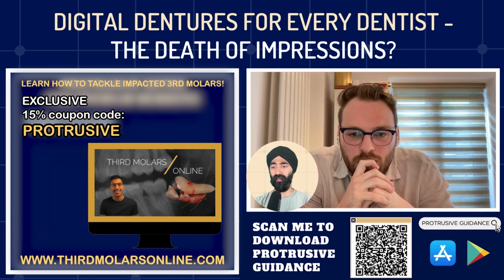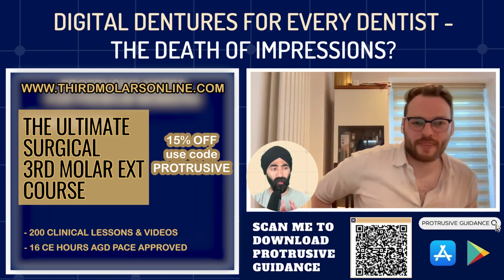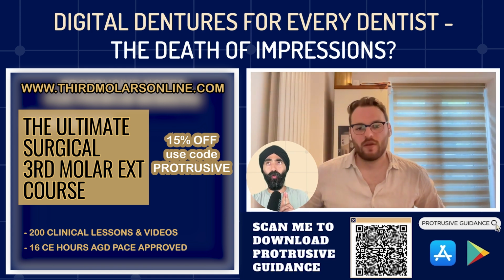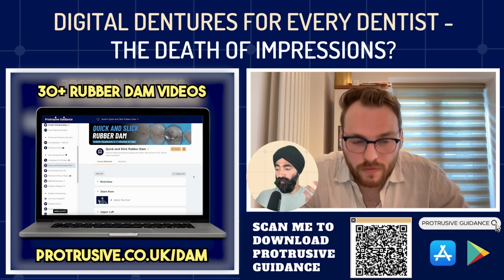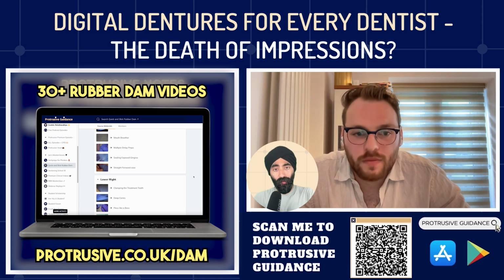Excellent. Well, I'm very excited to delve further into this. Cobalt chromes. Can we talk about chromes? Have we got time to talk about chromes, and then we can wrap up? Yeah, and this will be a nice meaty segment. You suggested that with chromes, we can actually do a lot more digitally, in terms of the data input, we might be able to get away with a lot more, because remember, chromes are tooth-borne in the sense that they're relying on retention of their teeth more than the mucosa.